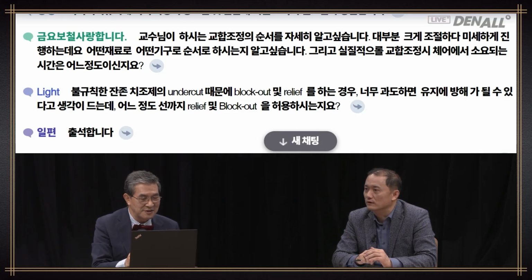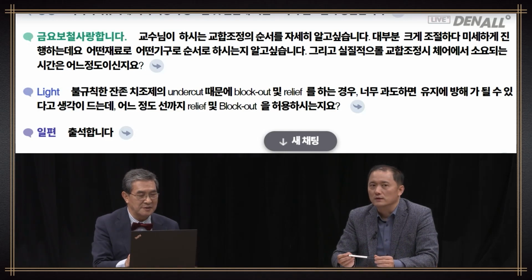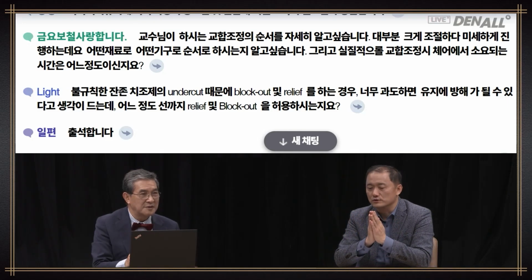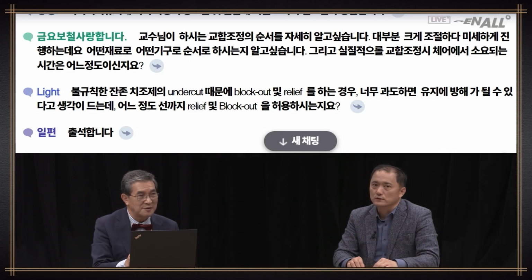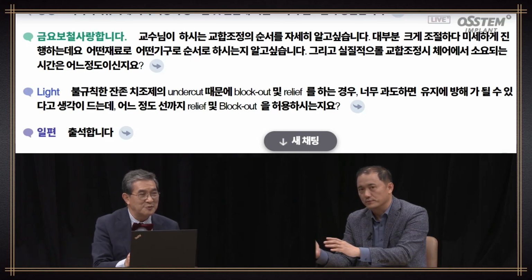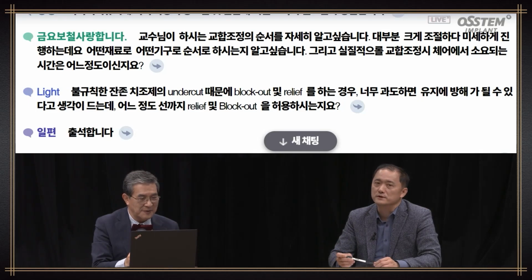The central relationship is the most important one, whether you do it in the articulator or in the mouth. As you know, you cannot really do it on the lateral side, and given that 70% of the result is determined by central relation, if that is okay, then retention becomes better. So first, central relation, and even if it is good, the patient finds it about 70% satisfactory. Then I use thick check bites, or both in different colors.